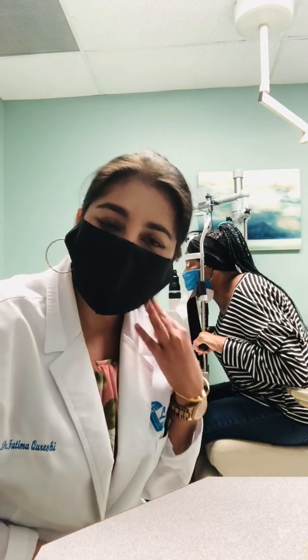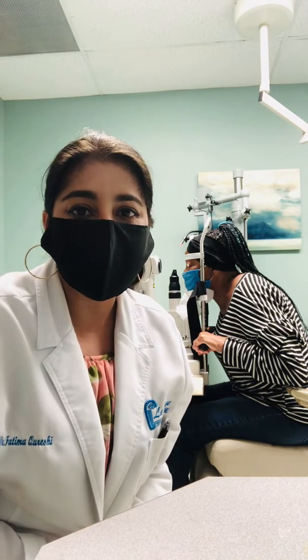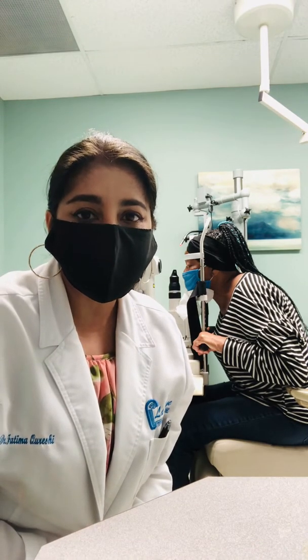Hello everyone, this is Dr. Fatima Qureshi. I'm here in the laser surgery room with a patient who has signed the consent for this procedure.